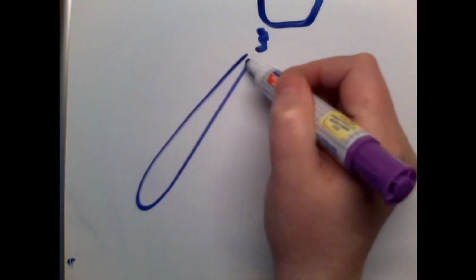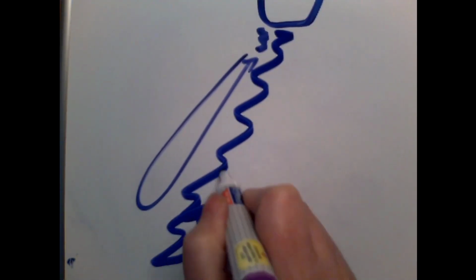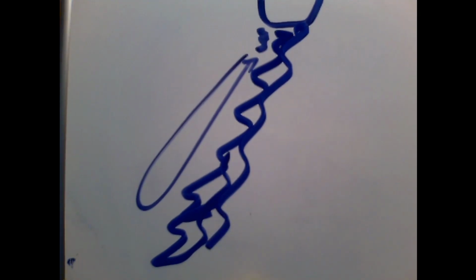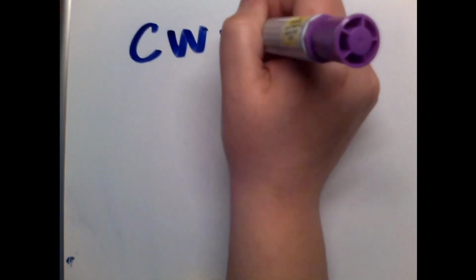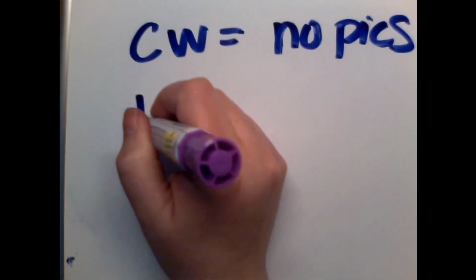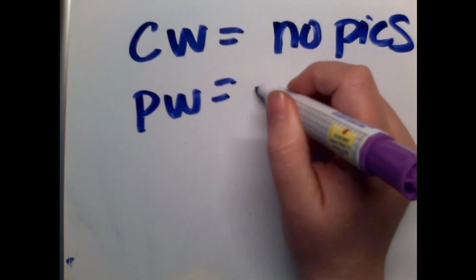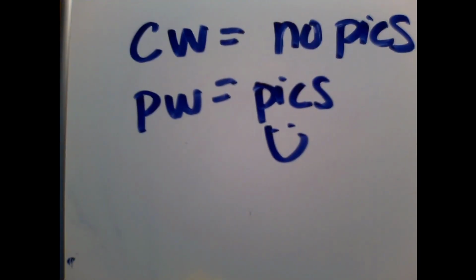And so that kind of goes back to our transducer again. Remember, it would send the pulse out, and then it would go down and wait, and we'd have to wait for that pulse to come back. Well, if there's always just a pulse going out and a pulse going out, we're never going to get a picture back from that. We never really get the echoes back from that. So we cannot create pictures from continuous wave. So continuous wave, no pictures. Pulse wave, again, is what we use in our daily ultrasound for diagnostic medicine. We get pictures from pulse wave.